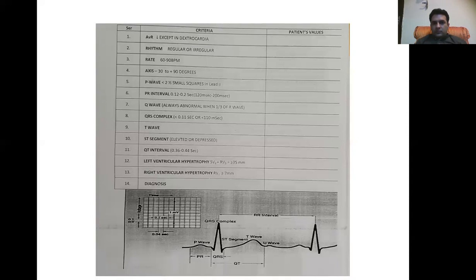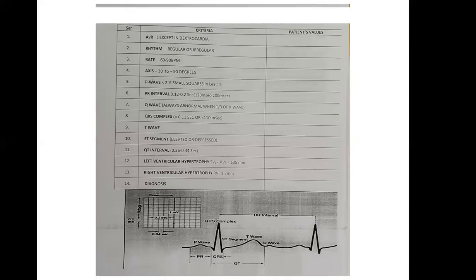ECG is very important for all the anesthetists, rather for all the doctors. But for anesthetist, it is very important because during anesthesia, you continuously monitor the ECG tracing, and for any intervention, you need continuous ECG monitoring. This is basic monitoring for anesthesia delivery.